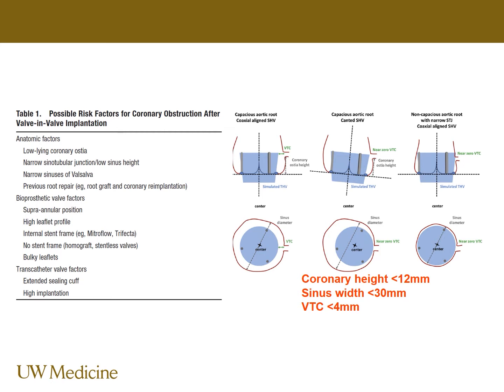But not only is it important to look at these various distances when trying to predict, but also understanding the position that the bioprosthetic valve has in place, as well as the potential issues of having somewhat of a canted heart valve placed into the surgical valve, and thus creating this somewhat canted orientation, which is very well demonstrated in the middle image.